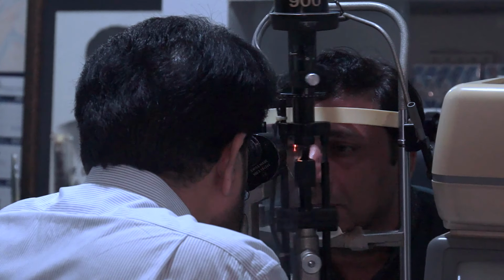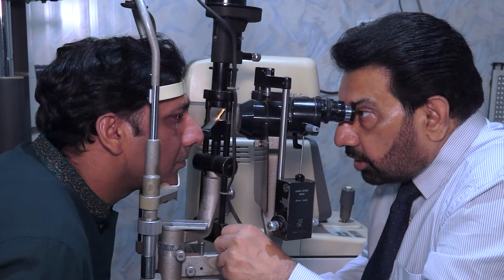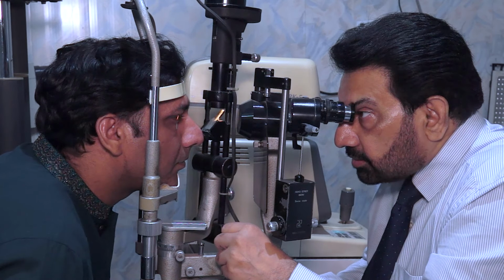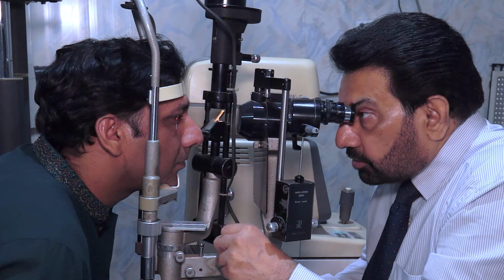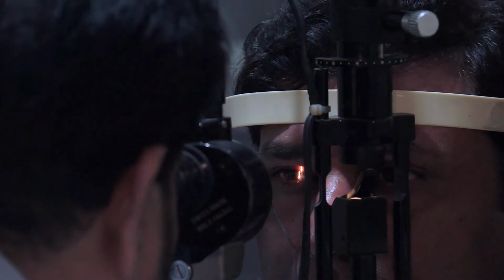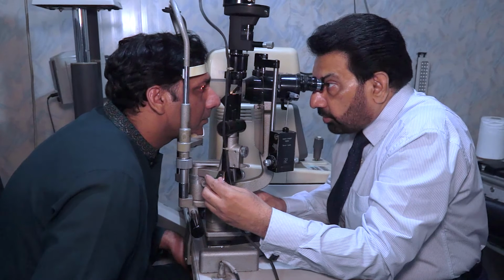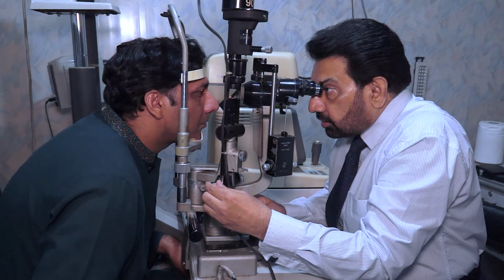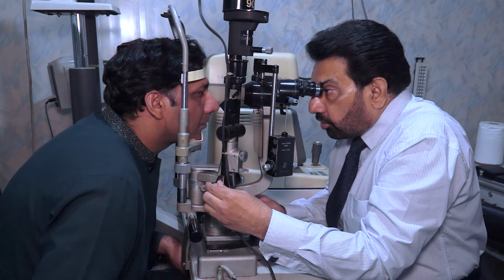We make an angle of the illumination with the observation system, also called the viewing system, and we make a slit, and this slit of the illumination is now at the same focus as the viewing system is, and with this we can see more details of any abnormality, and it can give us the width, the depth, and also the height of that abnormality.